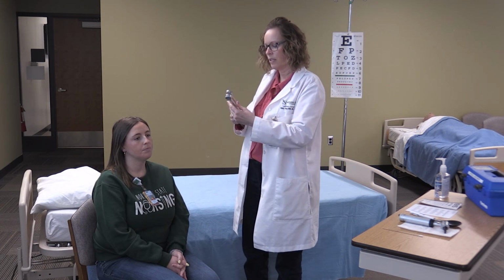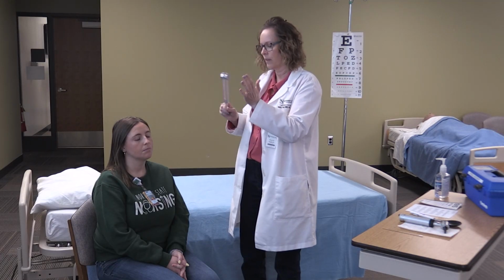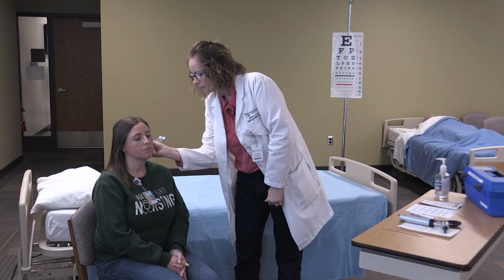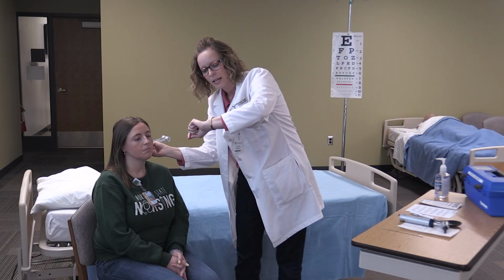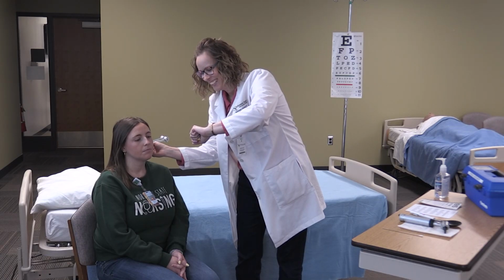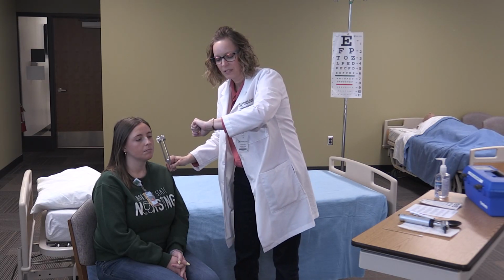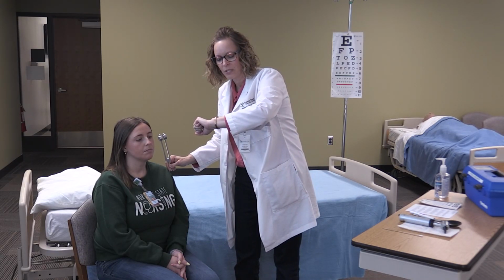Again, you don't want to touch the main part of it, you want to touch only the bottom. And you want to count how long she feels it, sorry. Then we're going to move it here to see how long she hears it. We should have a 2 to 1.